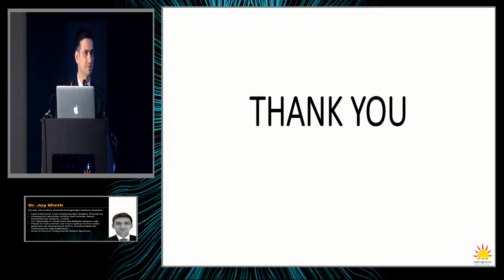Just a couple of points. Always keep lubricant handy because when the patient tries to keep the eye open, especially if you're trying a 12 by 12 scan, they tend to get tired and the eye gets dry. So always keep some artificial tears there. If the patient has poor vision, don't ask for a wide scan because you're not going to get a good picture anyway. And if you're doing lesions like diabetes and CSCR, ask for scans also centered on the optic disc so that you can pick up things that are needed.